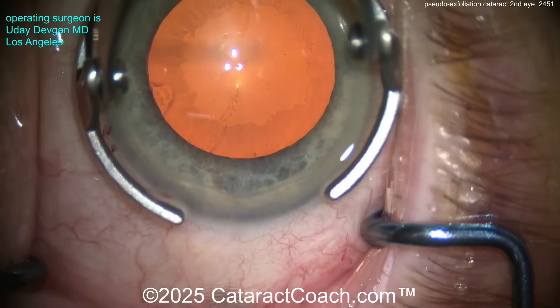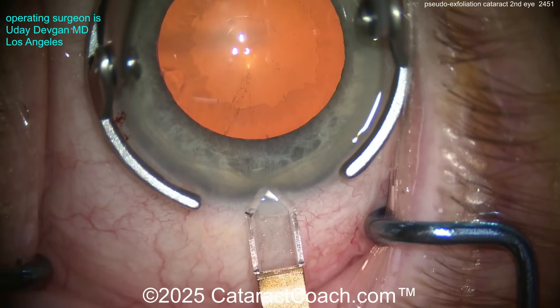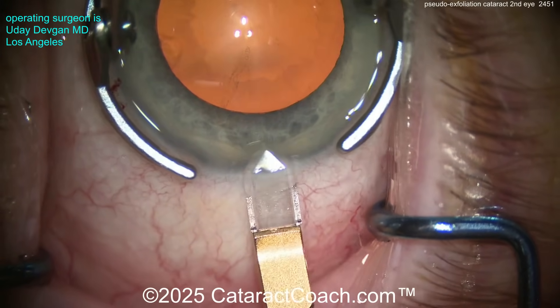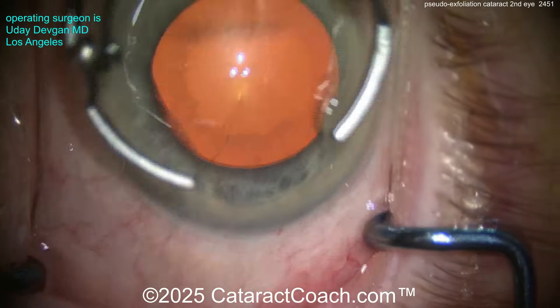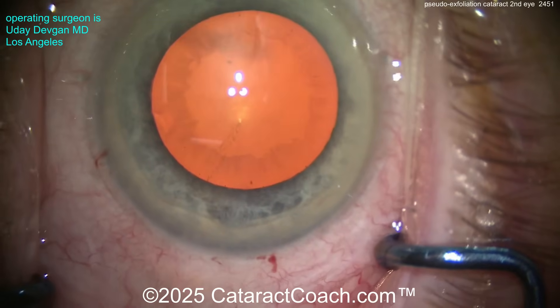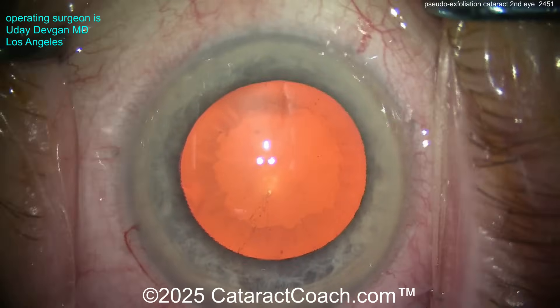You can see we're making our incision. First thing is we want a big rhexis. You've heard me say before: no baby rhexis. We don't want a baby-sized capsule rhexis. Don't make a four-millimeter capsule rhexis here — it's more likely you're going to cause issues. So we're going to get a good-size capsule rhexis going. There's the incision. That all looks pretty good.